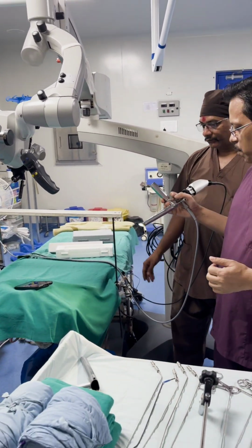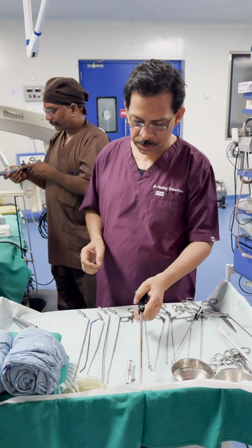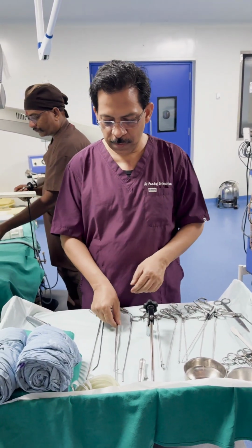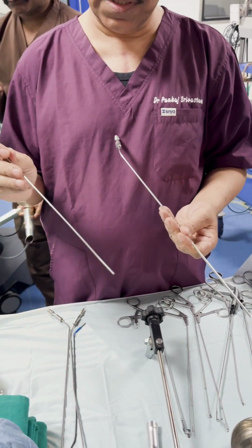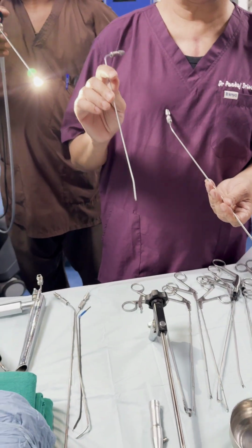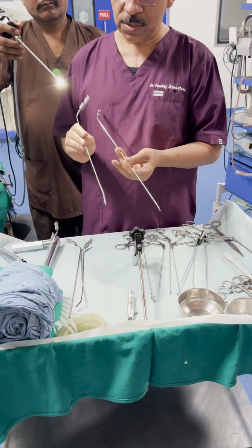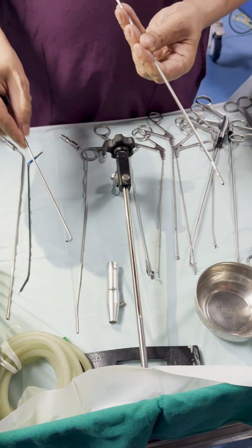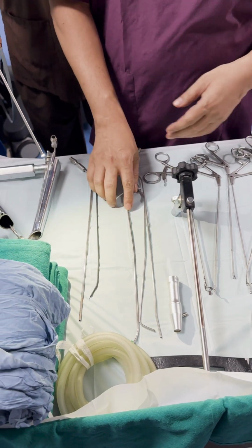So now what are the instruments or adjustments which can be helpful in seeing the anterior commissure? So seeing is that, and working. Now we have 3 suctions available. We have to turn our instruments because we can see the lesion, but touching, doing suction or operating becomes difficult. So for suction, we have 3 tilts: mild tilt, moderate, and too much tilt. So whatever the situation, we can use the suction.